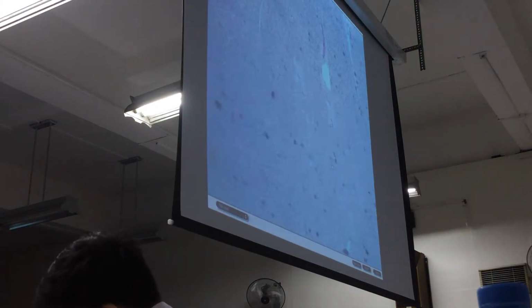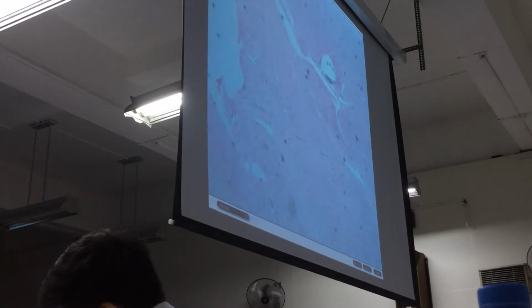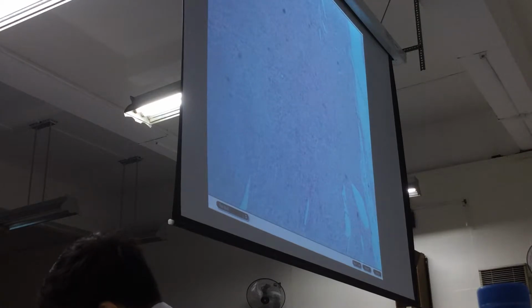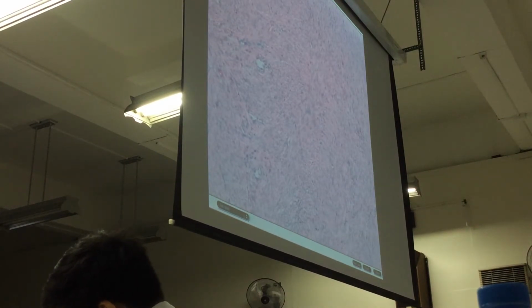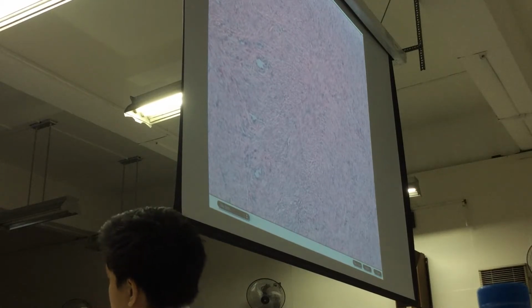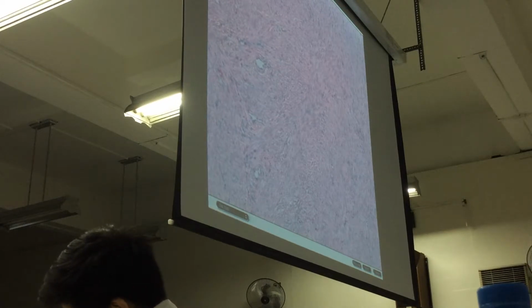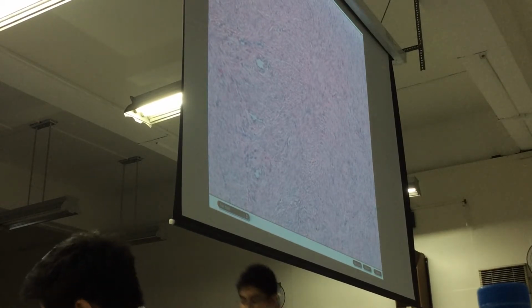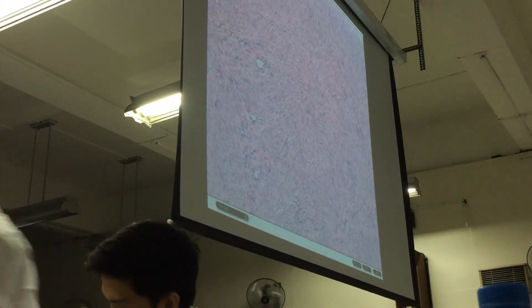The slides will show you basically the histology of smooth muscles seen with the myometrium. Did you see the gross specimen? They are labeled outside, so you can look at them anytime, maybe after your exams, on Thursday or on Friday, because they may come out during the practical exams. Okay.